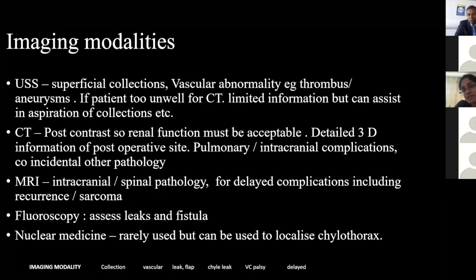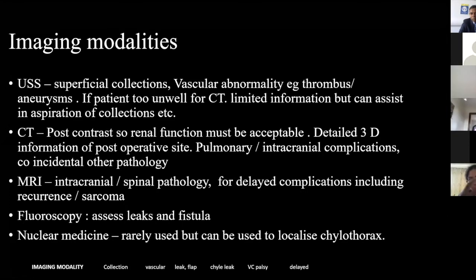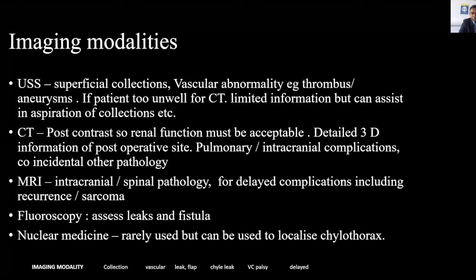We've had a previous discussion where somebody talked about somebody having a gallbladder perforation. So things like that are very common, or maybe not quite as common as we would think, but it certainly happens that just because they've had a head and neck surgery doesn't mean that they cannot have a subacute bowel obstruction or a stroke or any of these things. So CT can be used safely in those conditions, and you can get a very fast turnaround.